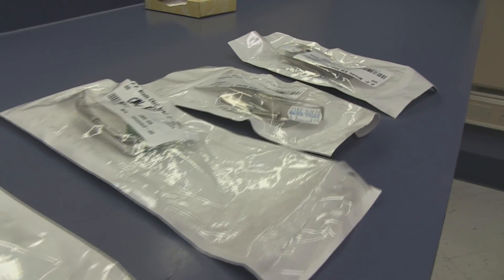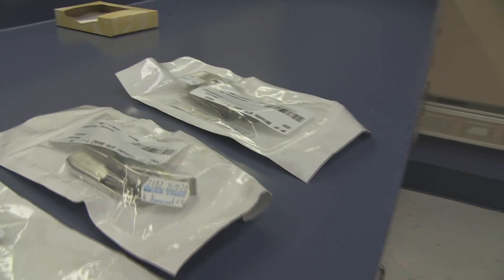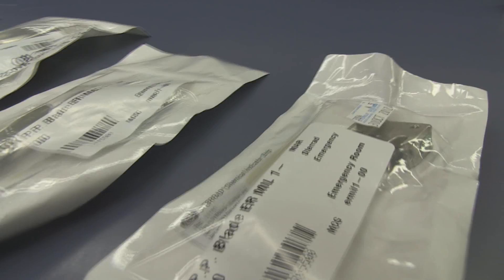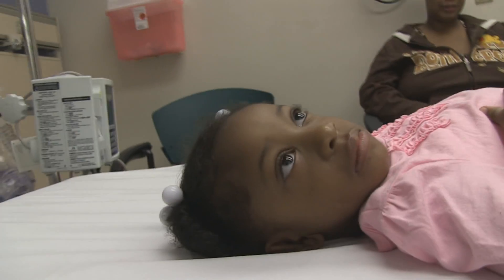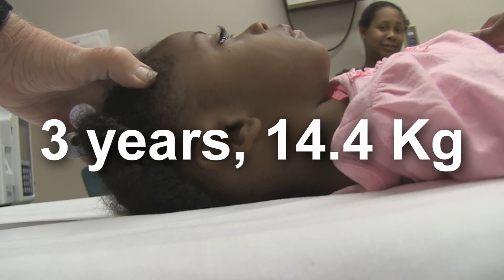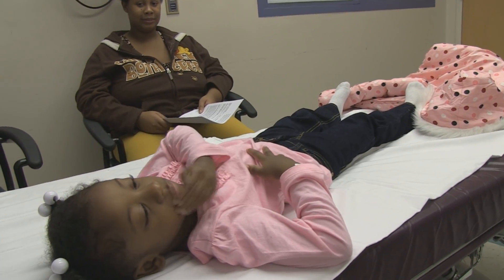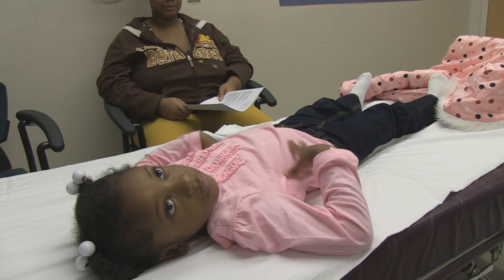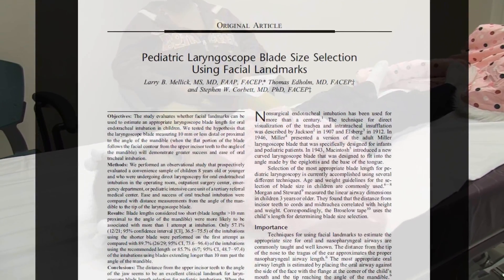Here's a Miller Zero, a MAC-2, a MAC-1, and a Miller Blade 1. But on this little girl here, what size blade do you think we are going to use? We are going to use the recommendations that come from a 2006 study that talked about using facial anatomy to make that decision.